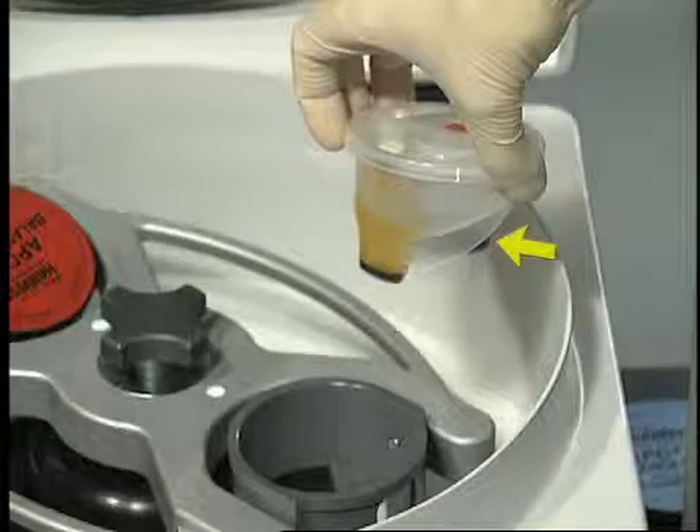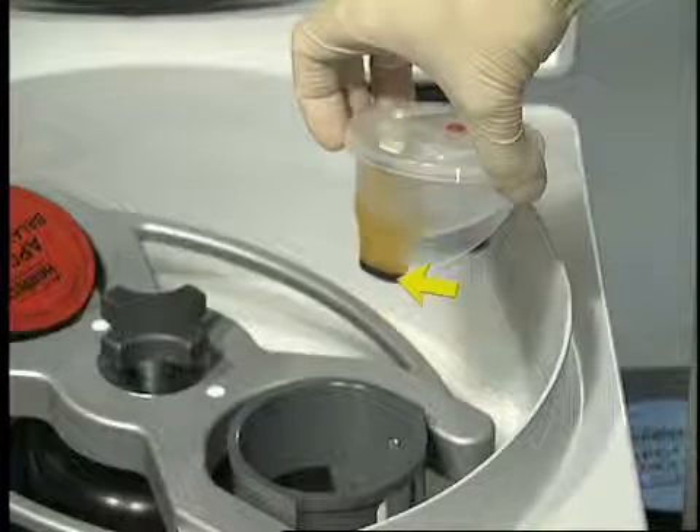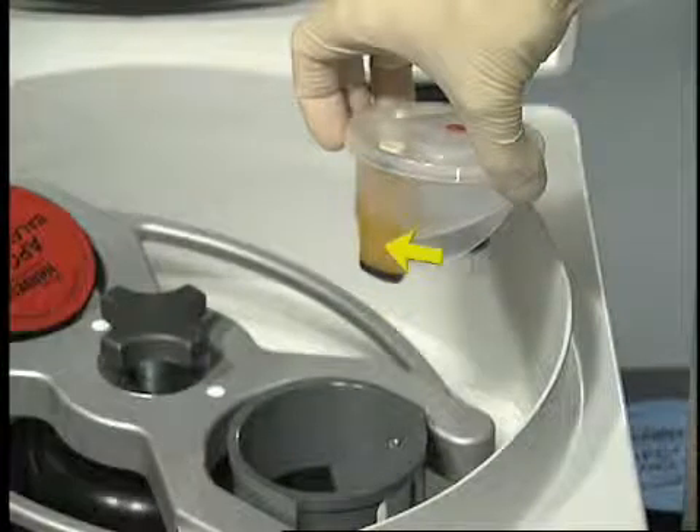The blood chamber of the process disposable contains the red blood cells. The second chamber contains the platelet concentrate, a button-like precipitate, and platelet-poor plasma supernatant.